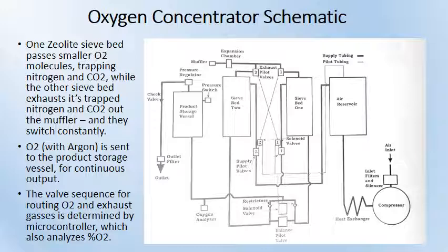Then it goes into an air reservoir so that the air coming from the compressor is not pulsed. It's also filtered. Remember, think of any air reservoir as an electrical capacitor. What it does is it damps down any kinds of transient behavior. So coming out of the air reservoir, you have a nice smooth flow.